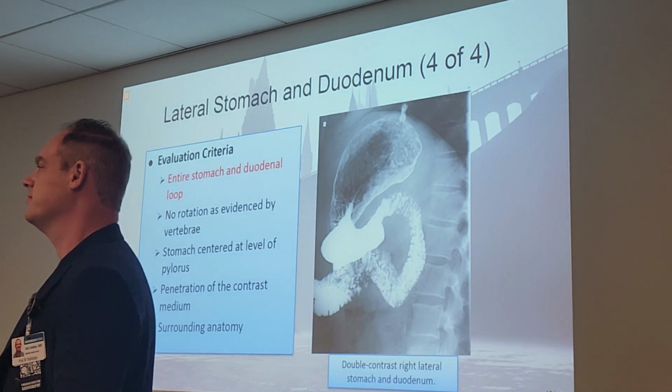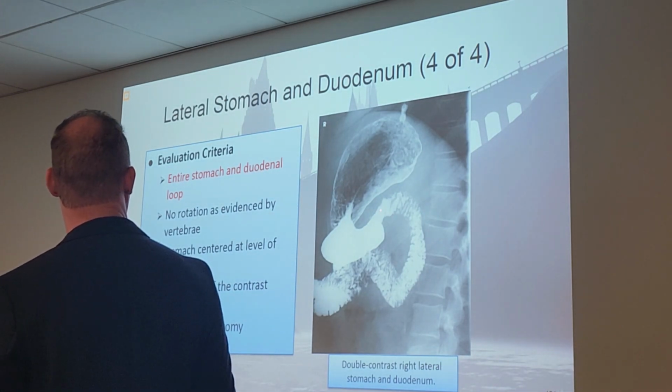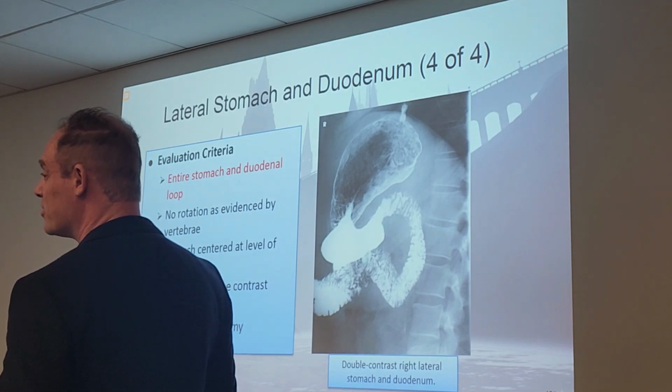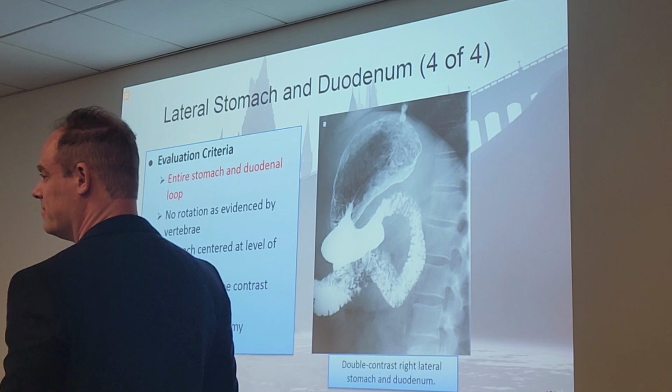Where's the bulb? The bulb is a little bit superimposed right here. I know it says it shows the bulb, but you can't really see it as well on that one. That's why the RAO is optimal for the bulb.